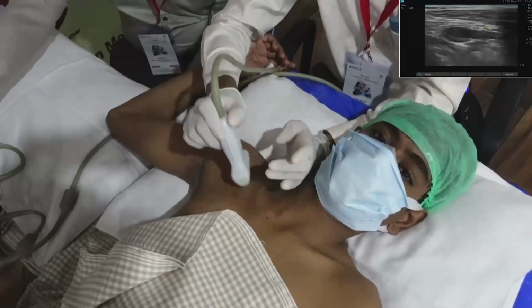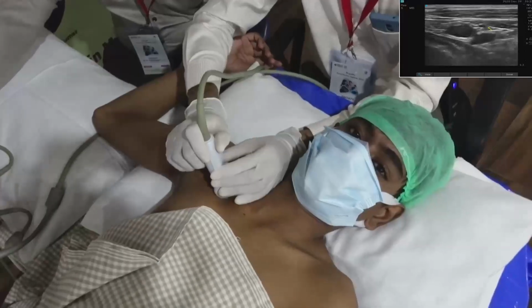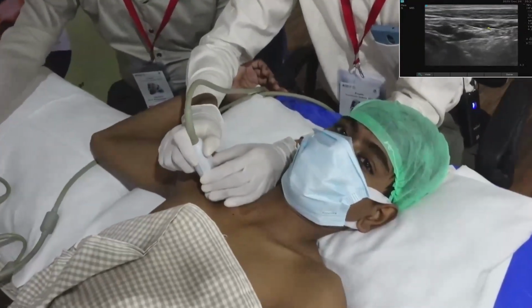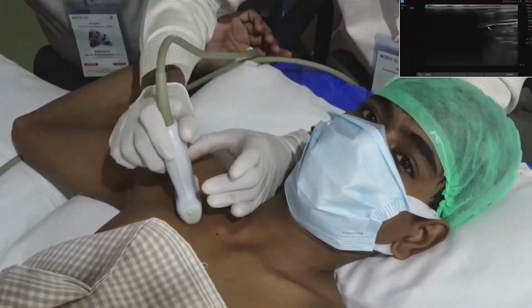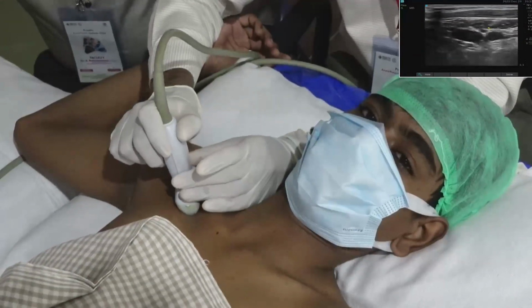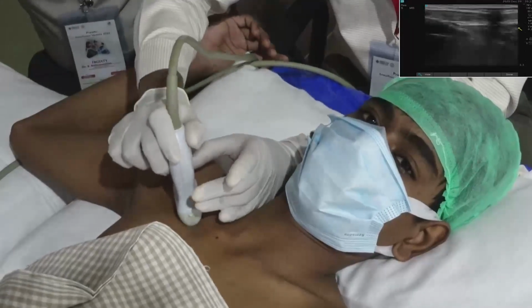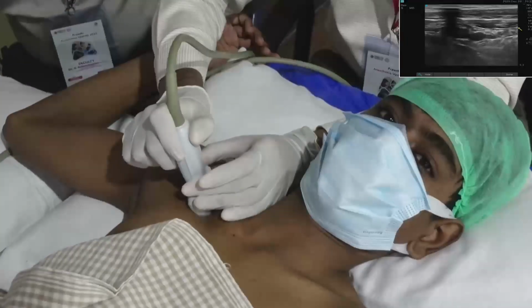If you are doing the scan at the level where the cephalic vein is draining, our scanning is not proximal enough. Two simple ways to identify this: first I am going to scan the costoclavicular area. In this costoclavicular area, we see only cords. If you want to see the cords properly, don't look for cords.